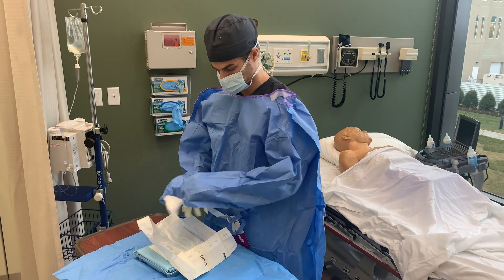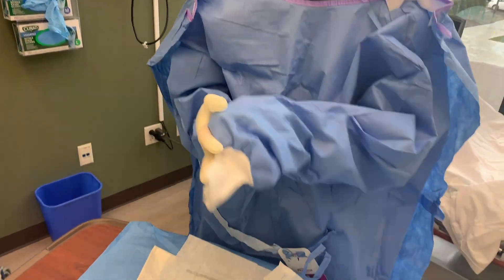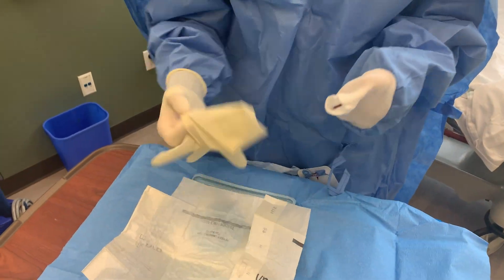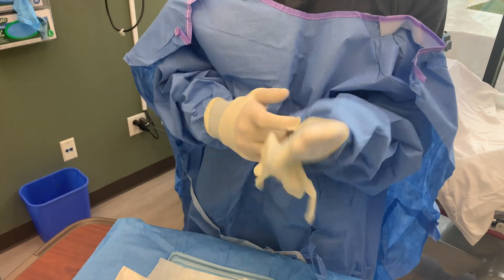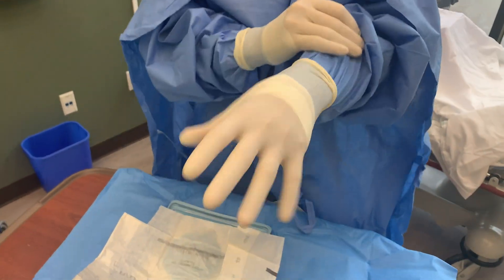With your fingers still behind the white sleeve cuffs, open and place the sterile gloves, having the gloves come over the white cuff of the sleeves. When available, have extra staff secure the back of your gown to prevent contamination.